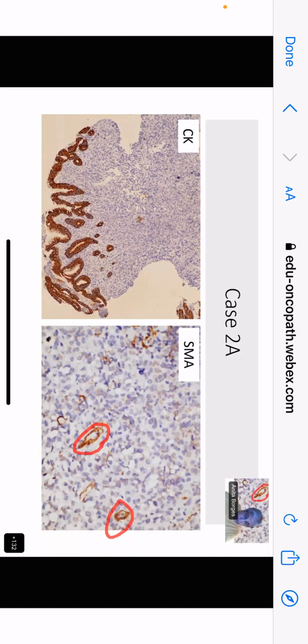What do you think, Suvaita? Yes, ma'am. Tumor cell. Where is the nucleus of that tumor cell? Can you show me? Mark the nucleus of that tumor cell. Right in the center. You don't think that this is a vessel in which you've got something that's there? You've got a ring, you know? So what do you want to say?